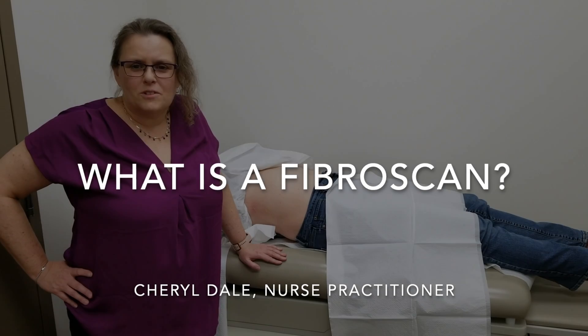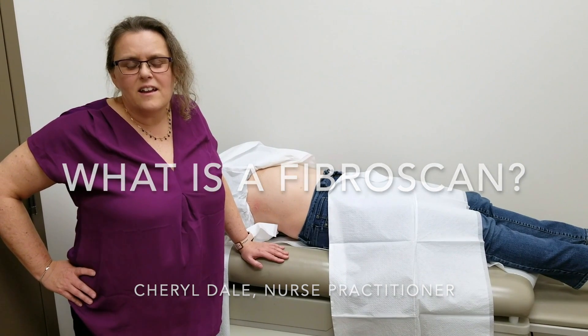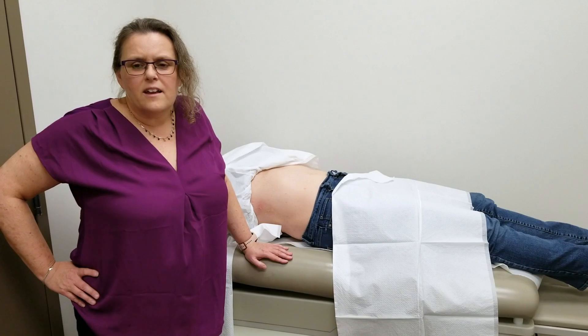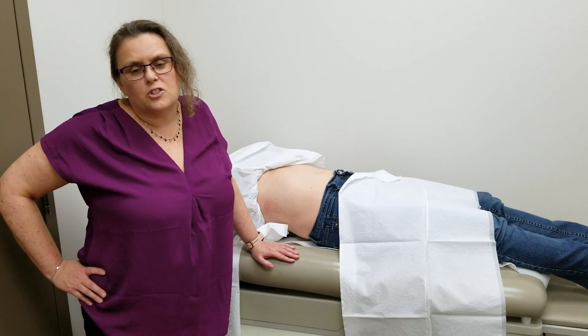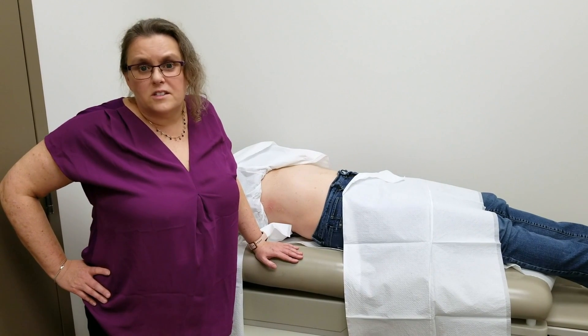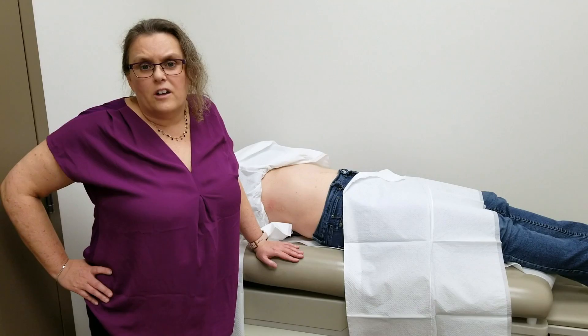I'm here today to demonstrate a FibroScan. Patients often ask questions because they've heard about FibroScan but don't know what it entails, and it may be a scary concept to them. This is just a small demonstration of what it entails, to show them it is a very easy, non-invasive, and painless test that will provide their doctors and nurse practitioners with a lot of valuable information.